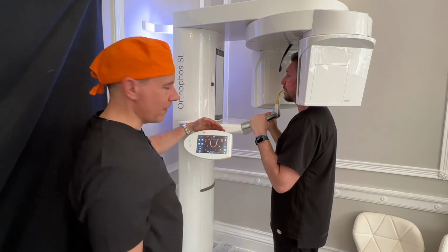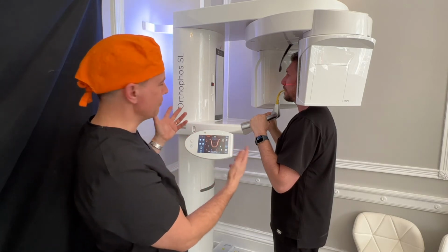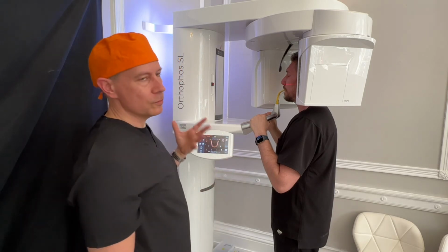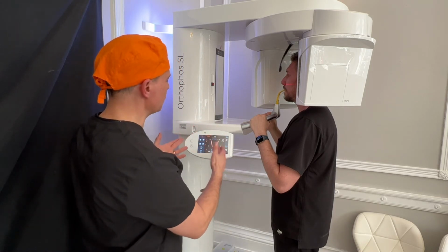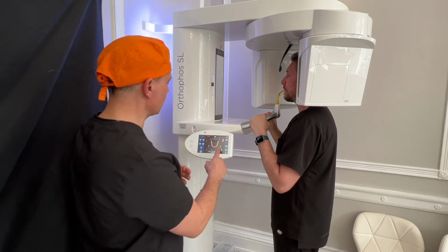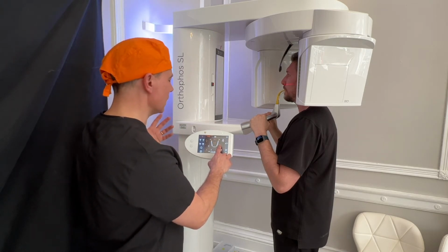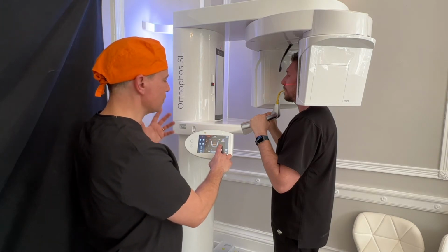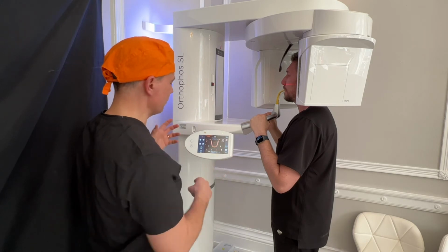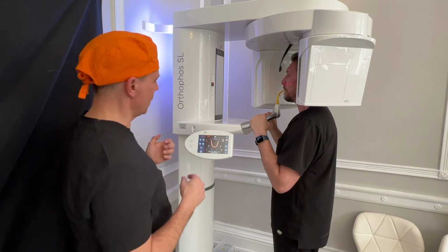On the screen we also have various settings for various programs. So I'm on P1 now, which is the full exposure, where we have the TMJs as well. Often we don't need to have the TMJ in the exposure, so we move on to program 2, which will cut it a bit further. And also we have a kiddie program as well, which is even shorter. There's a number of different settings here that we don't really use much, like the TMJ and the bite wing settings. These exposures tend to be replaced by the CBCT version for us, but if you haven't got the extended CBCT settings on there, then they are useful.